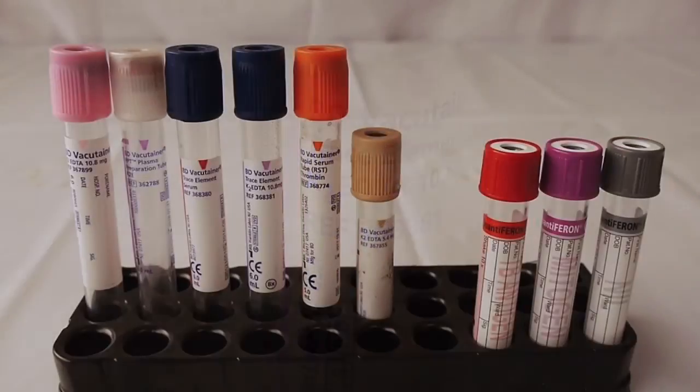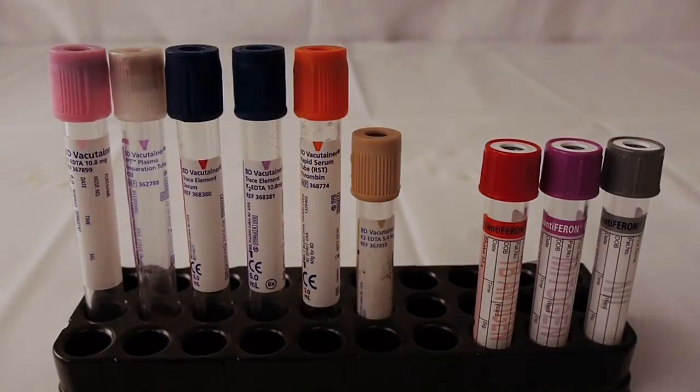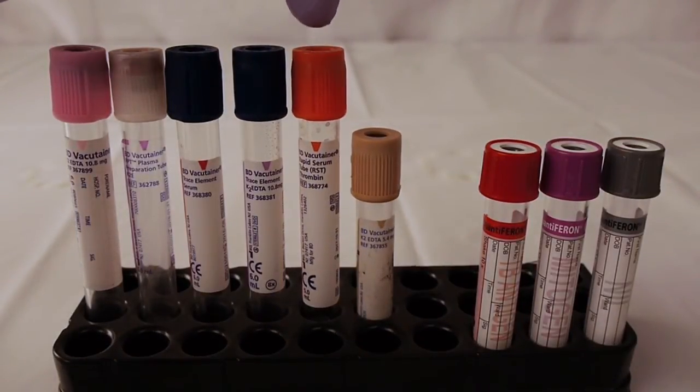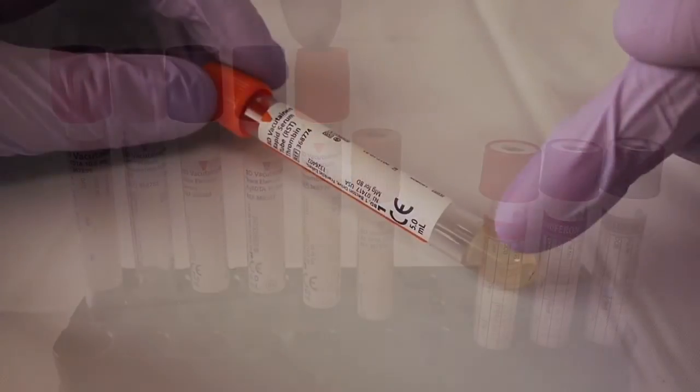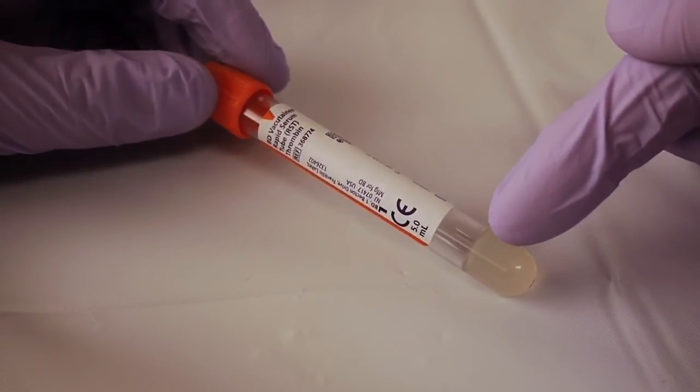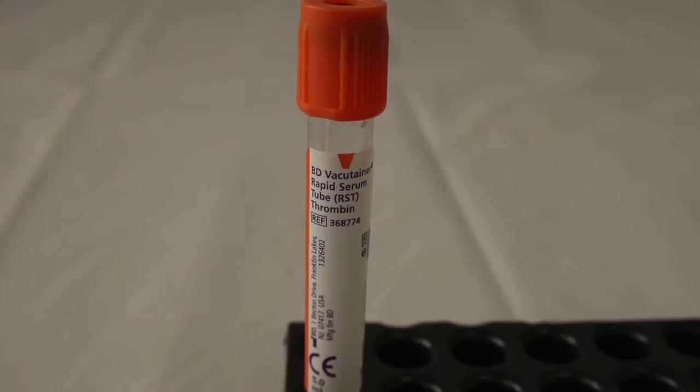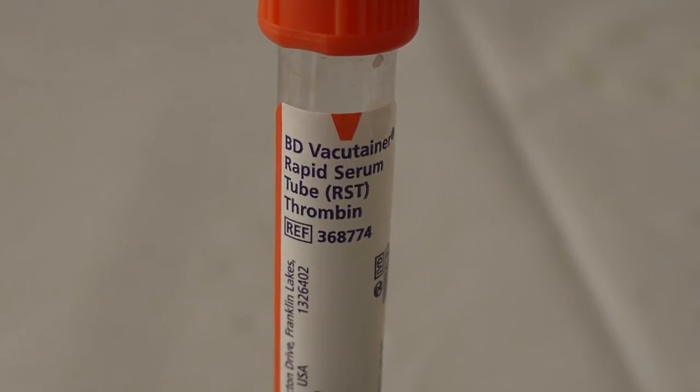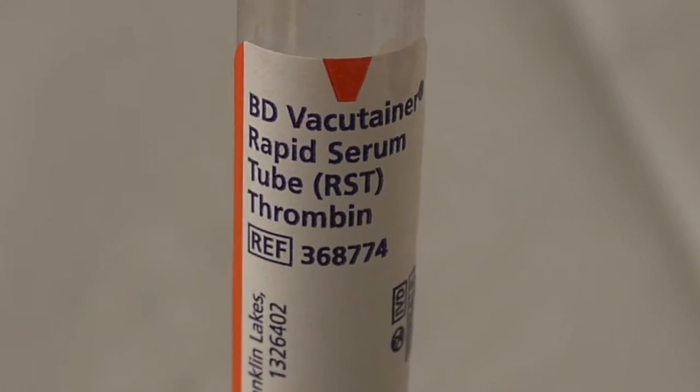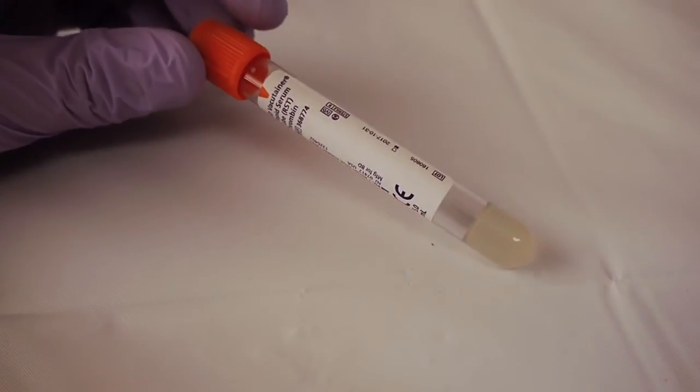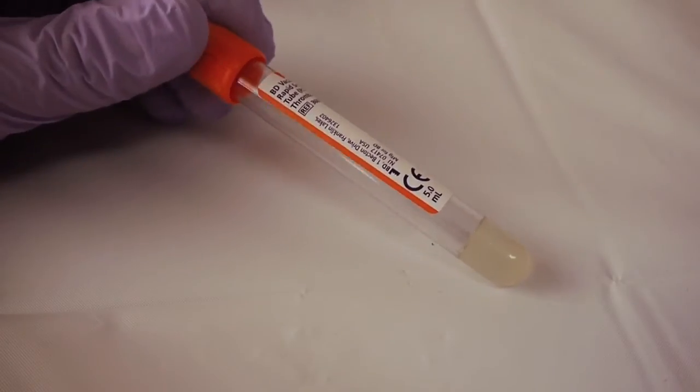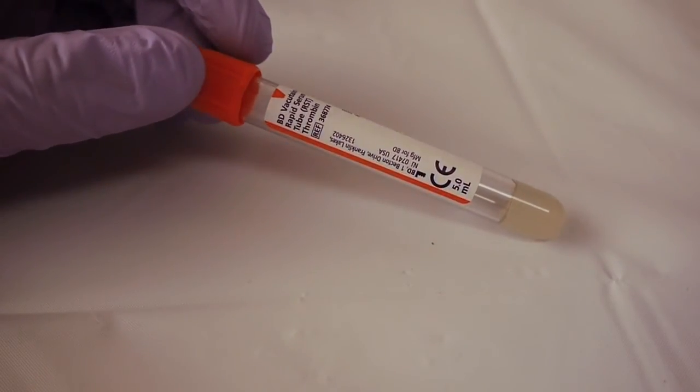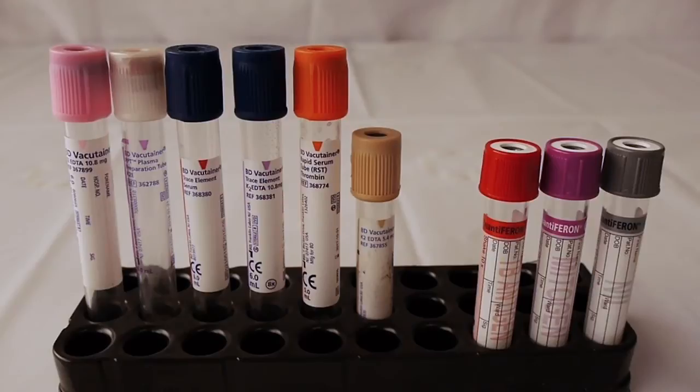The next tube we have is the orange top tube, also has a gel barrier. This tube has an additive known as thrombin. Thrombin is a super activator for clotting. This tube will clot under five minutes, and it is used for stat chemistry.